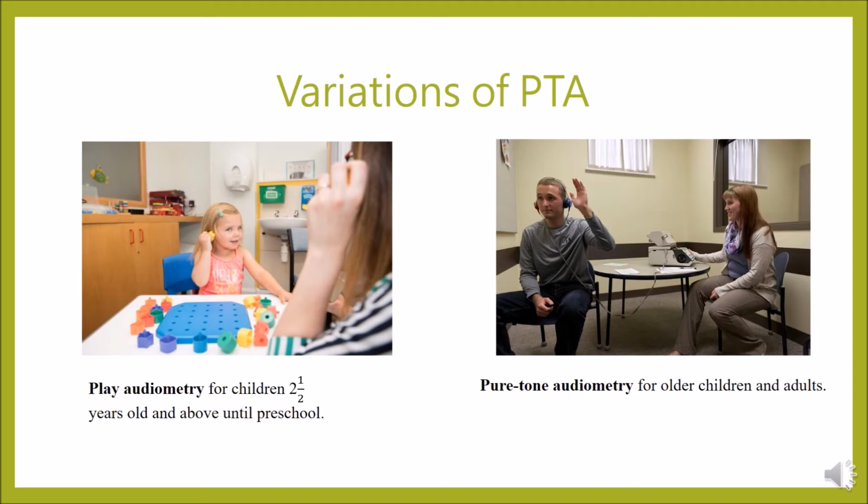Because we typically perform hearing screening in a school setting which involves younger children, it is often preferable to conduct screening using play audiometry suitable with the age. There is also another test that also uses audiometer, which are behavioral observation audiometry (BOA) and visual reinforcement audiometry (VRA). However, these tests are unlikely to be used in screening outside a clinical setting, mainly because they need to be performed in a controlled setting and require bulky equipment such as speakers and visual reinforcers.